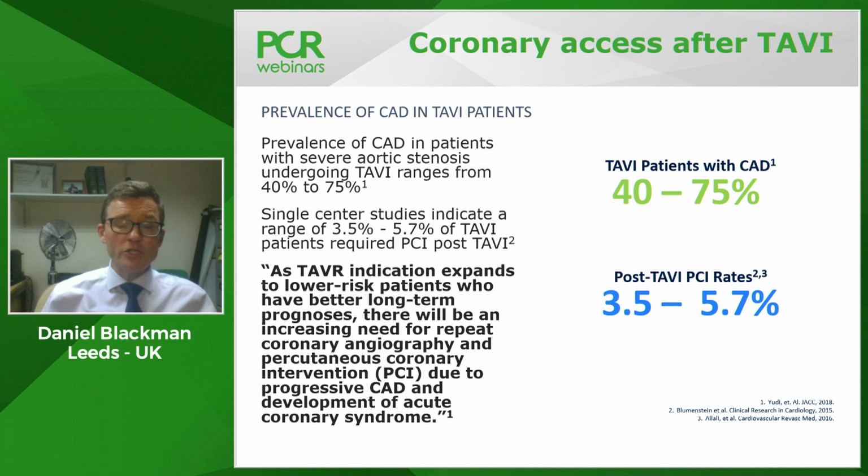So that's why it's going to be important, in particular with Evolut, to understand, as Gilbert will show later, how we can facilitate coronary access in the way we do the TAVI procedure, and also to understand, as we're going to discuss in the first part of this webinar, how when we do need to do access after TAVI, what are the tips and tricks?